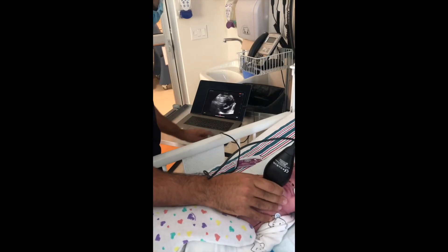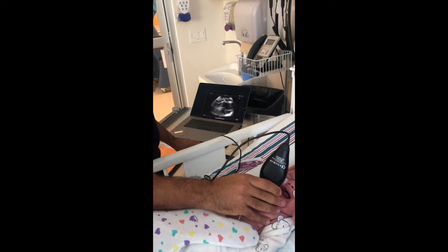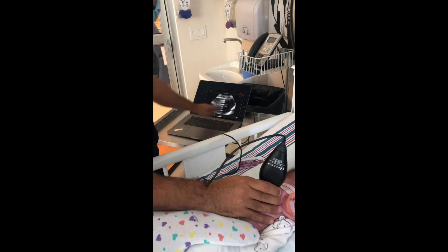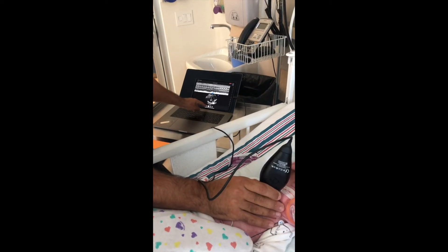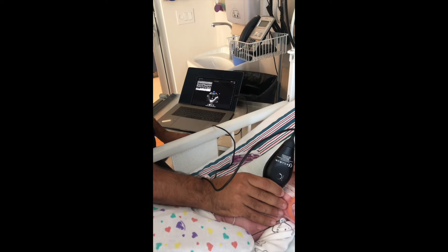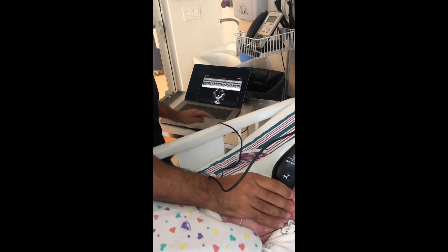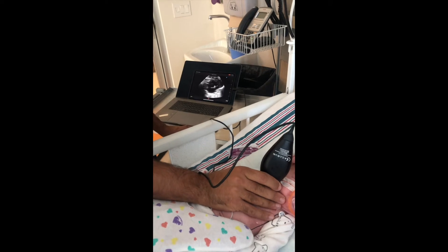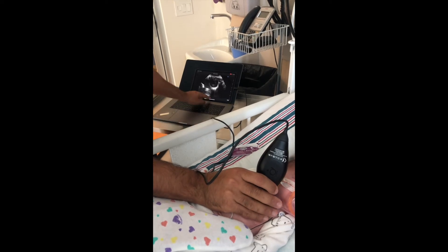Here I am obtaining a parasternal short axis. In this view, we can appreciate the septal curvature as well as the function of the left ventricle. In the parasternal short axis, you can use the M-mode function in order to measure the left atrial to aorta ratio, which can also be done in the parasternal long axis. You can also slide down towards the mitral valve at the tip of the leaflet in order to measure the shortening fraction, as well as the end-diastolic diameter and end-systolic diameter.